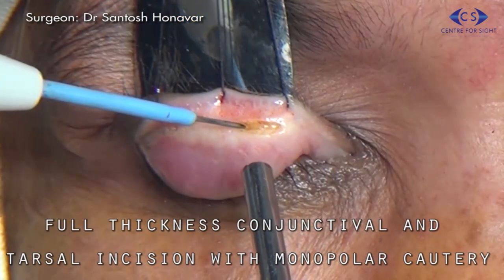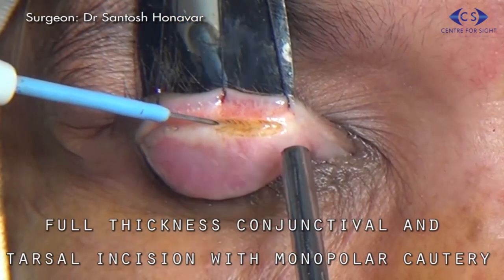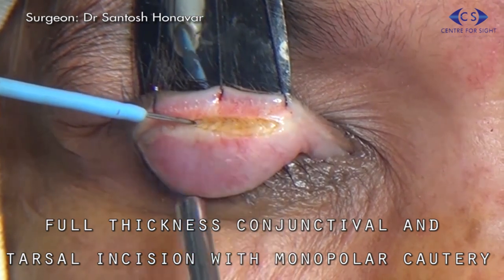Using a monopolar radio frequency electrode, the tarsus is incised full thickness along the marking.